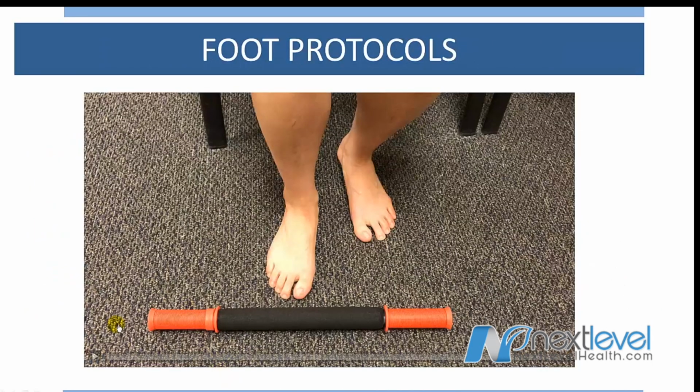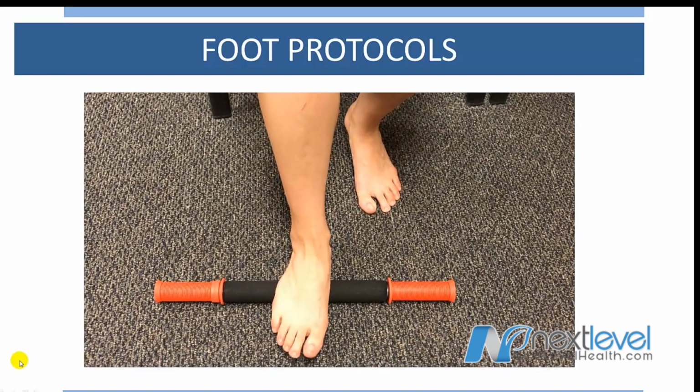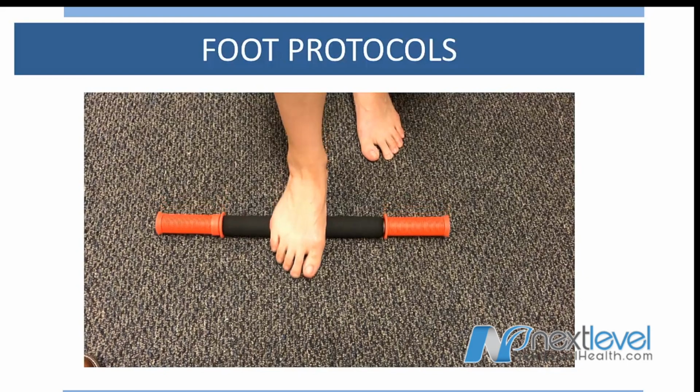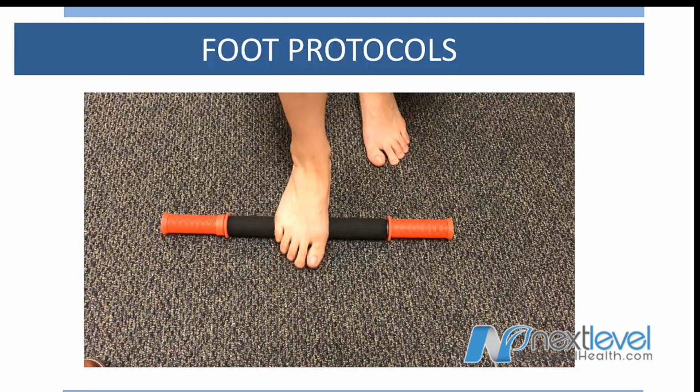This is a brief video showing you how you can use it on the bottom of the feet. What you're going to do is slowly put your foot on the pad and slowly roll back and forth. It should feel good, almost like a little bit of a massage. You can either roll your foot back and forth with big sweeping motions, or you can hold it in a smaller position on your foot and just hold pressure.